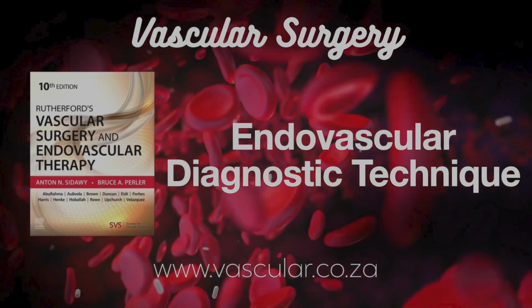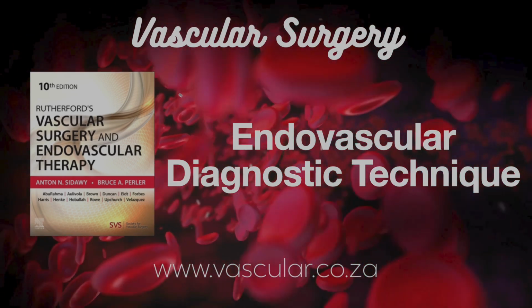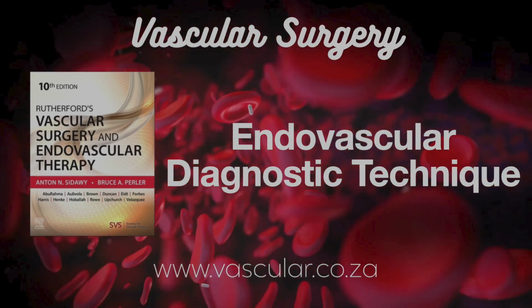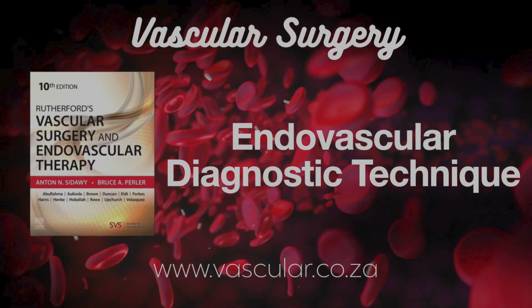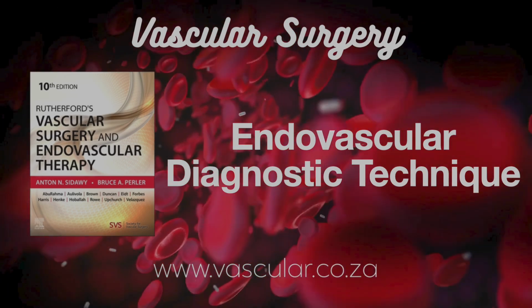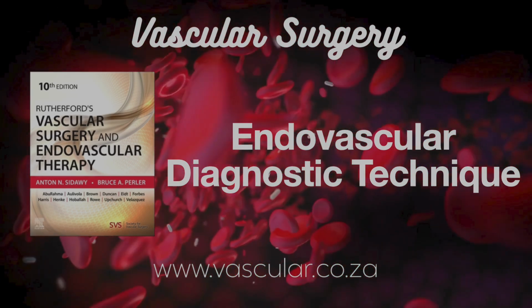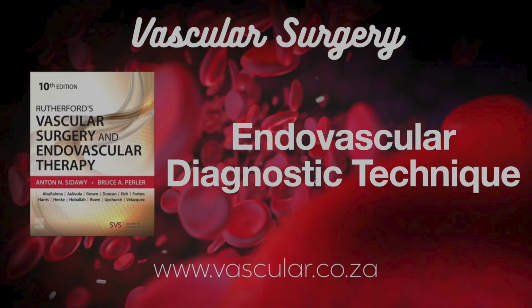Then radiation. Always follow the ALARA principle, as low as reasonably achievable. Minimize exposure time and dose. Crucial for patient and staff safety. Wow, that was a comprehensive journey through endovascular diagnostics. What are the absolute key takeaways, the core principles for success and safety?